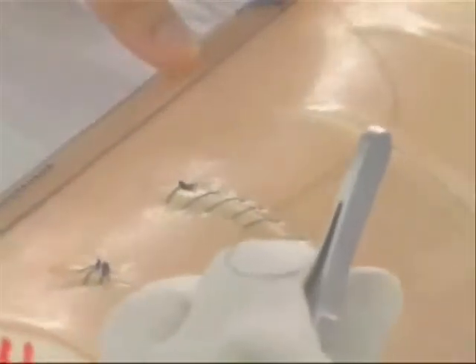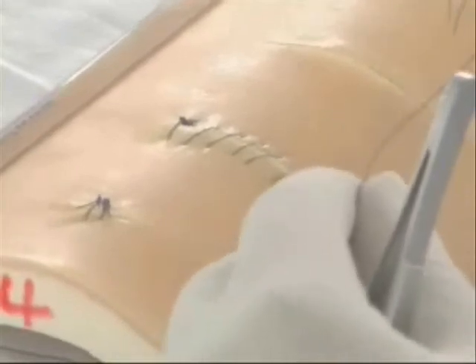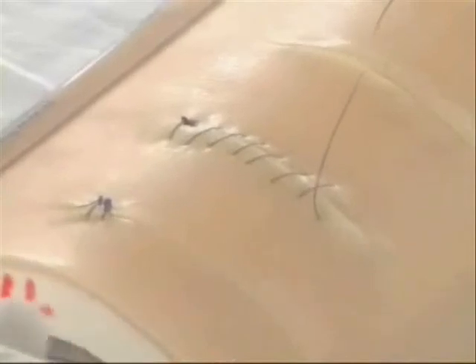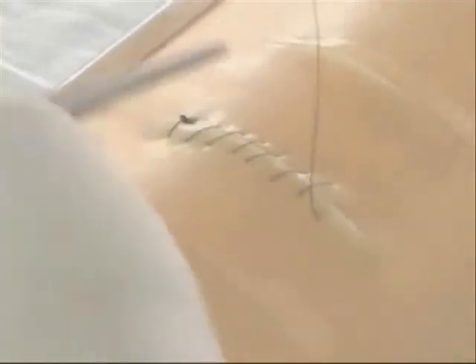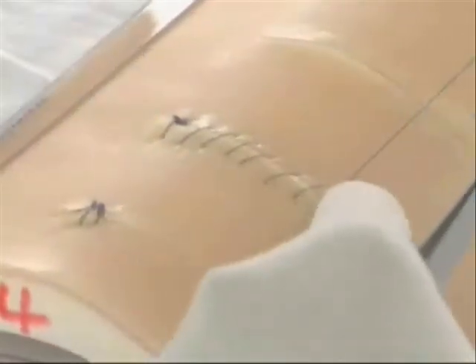So you can go on and on. If I want, I will now tie a knot, and that is a continuous suture. In case I don't like going this way and I want to make it straight, I can also do that.